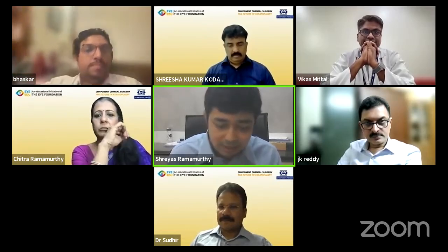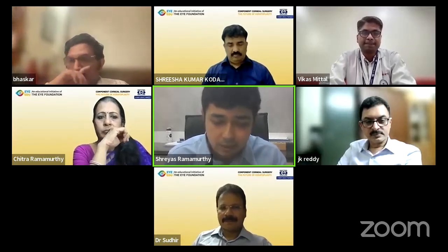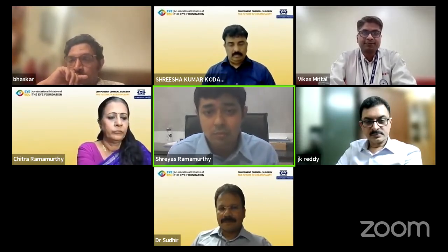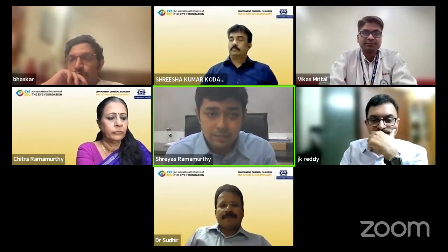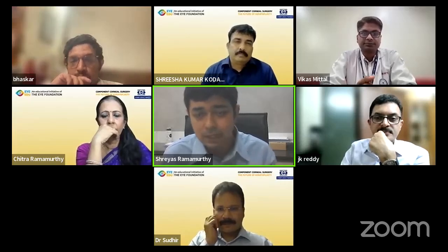Dr. Vikas, I've always known that you directly go ahead with manual in most of these situations, and you do show some wonderful post-op pictures, ASOCTs. The big challenge for most of us when we think about manual versus big bubble is that with a big bubble, your plane is obviously uniform. You cannot have variable amounts of thickness. Whereas with manual, the only concern is, will we have differential thickness?